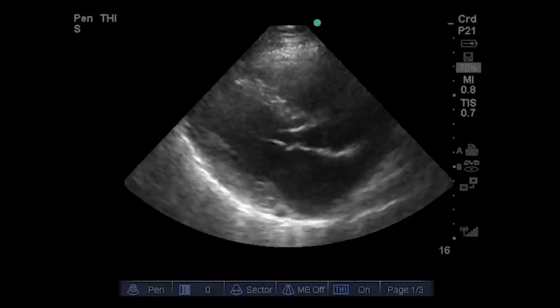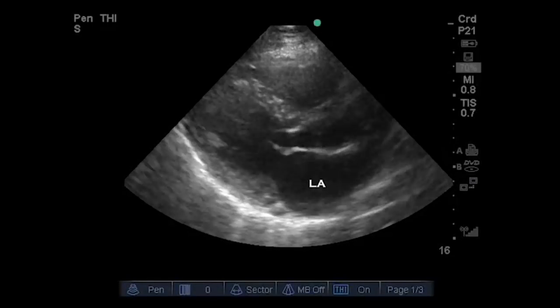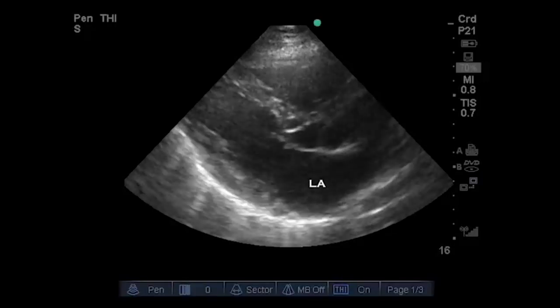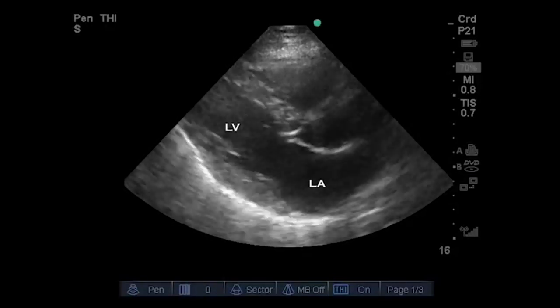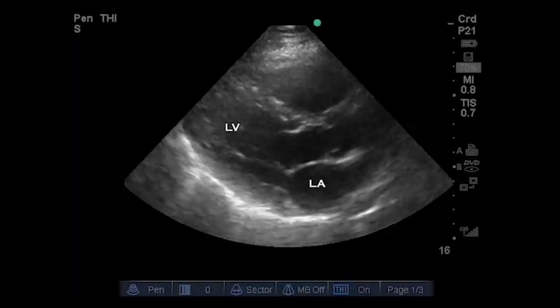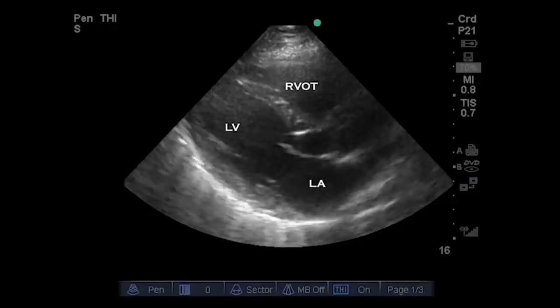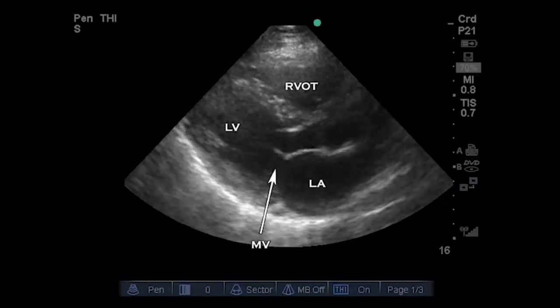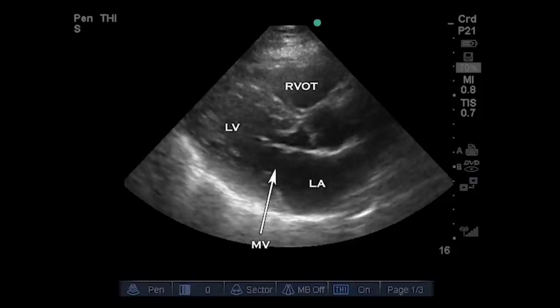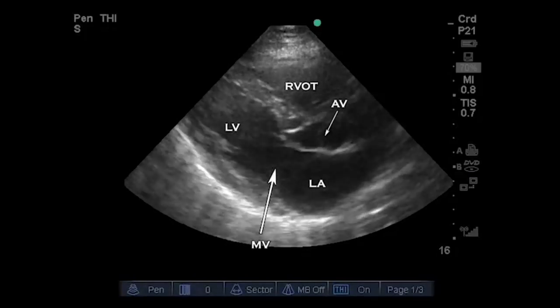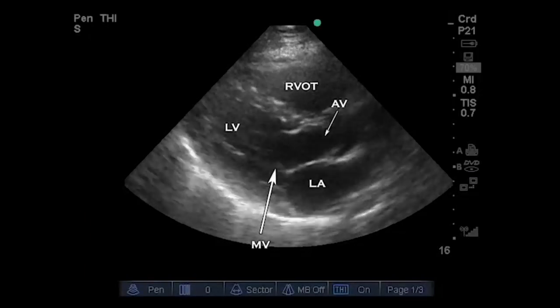Let's go over the structures that we're looking at. First we have the left atrium, followed by the left ventricular cavity. Then we have the right ventricular outflow tract. The mitral valve is well seen here, as is the aortic valve, and part of the ascending aorta is also visible.